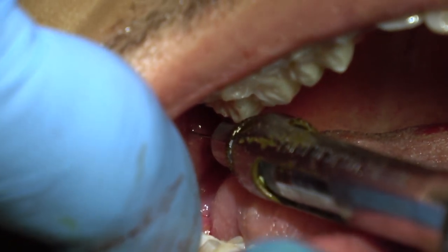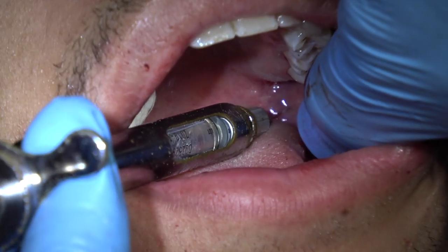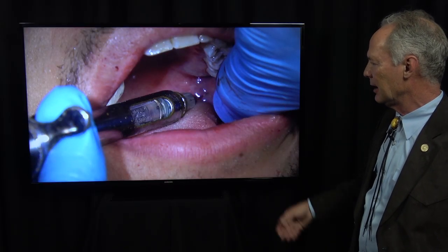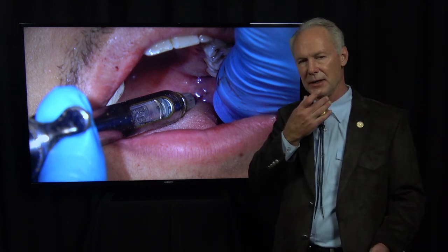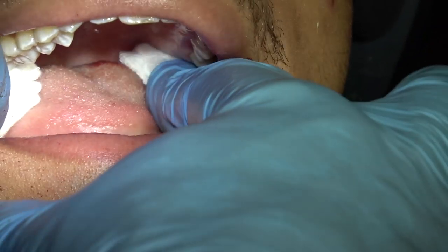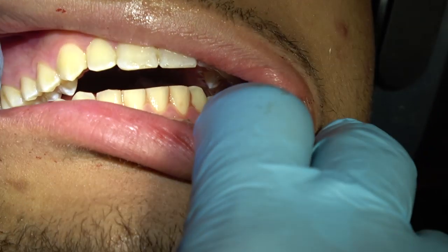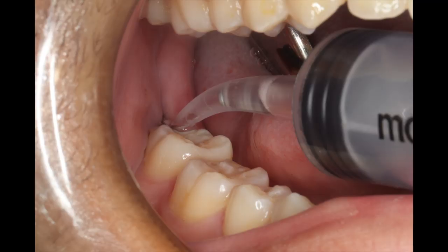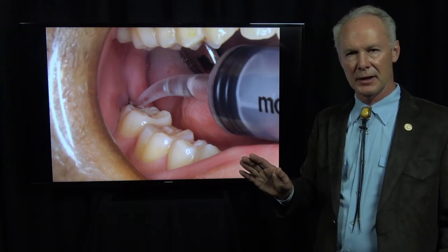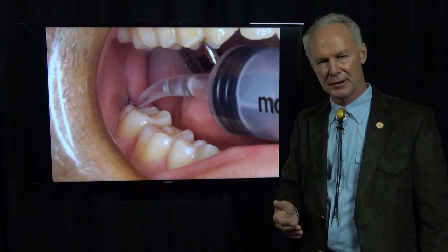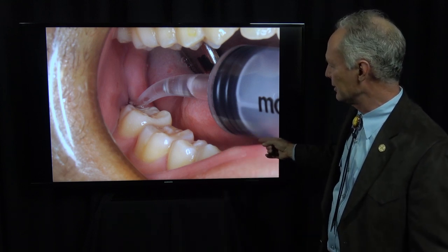Now I'm giving the patient an injection of Marcaine, which is a long-lasting local anesthetic, given at the end — that will keep the mandible numb for about 12 hours. Then bite down on two folded 2x2s. The patient returns in a week. You don't want to irrigate the sockets for a week, because it takes seven days for the connective tissue lining to form. The patient comes back on the seventh or eighth day and you show them how to irrigate the sockets.